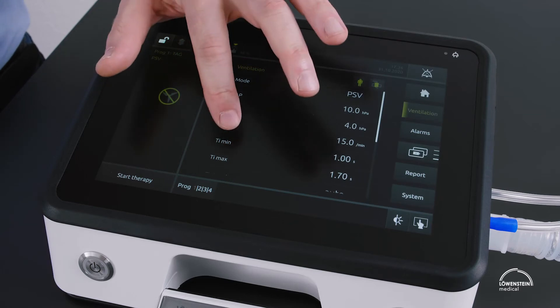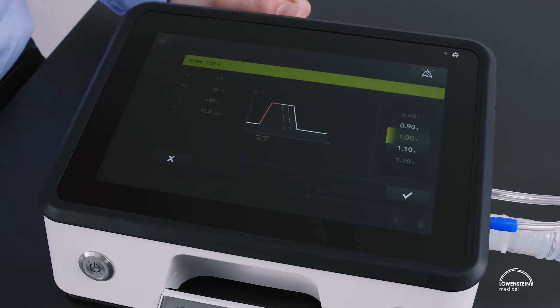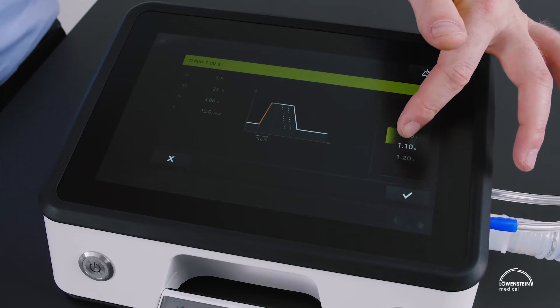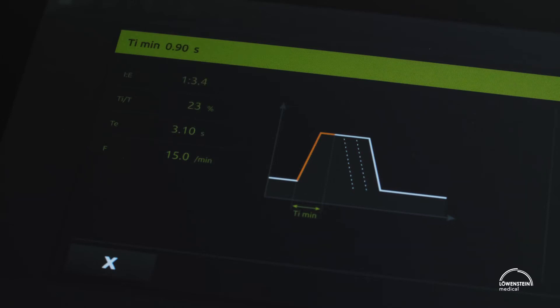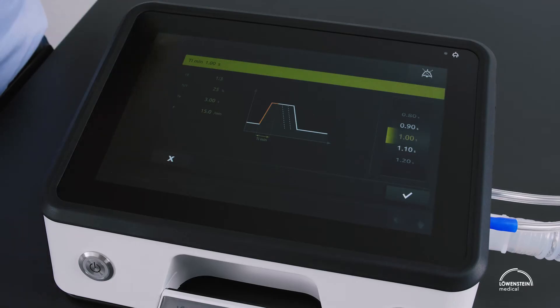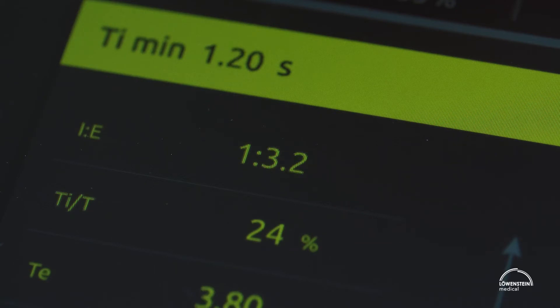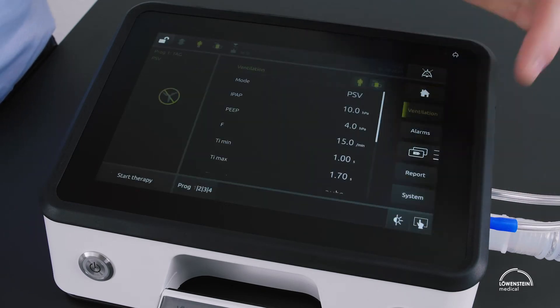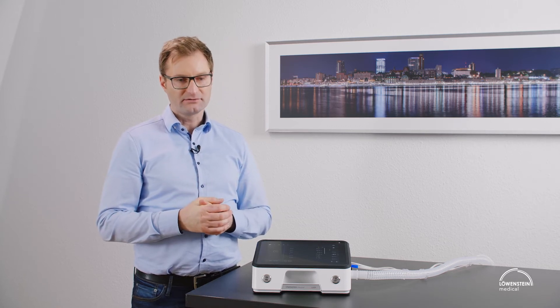I will show you the concept of LOUISA by setting the minimum inspiratory time. On the right we have our dial; in the middle is a graph that clearly shows what you are doing; and on the left side are the dependent values from the Ti min settings, like the I:E ratio or the expiratory time. I select my value, confirm it, and this is how we do all settings. You go from top to bottom and everything is set for this particular mode.